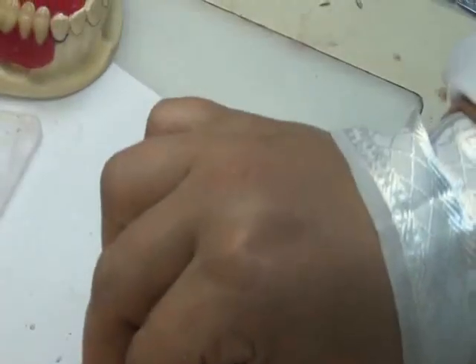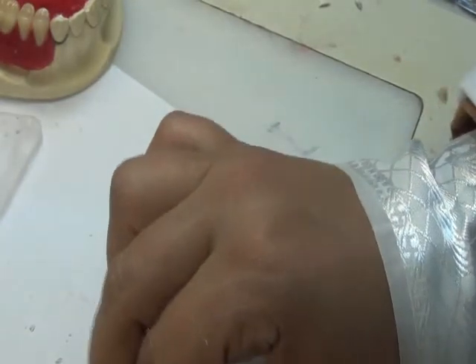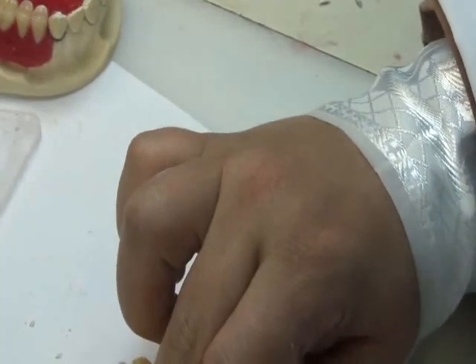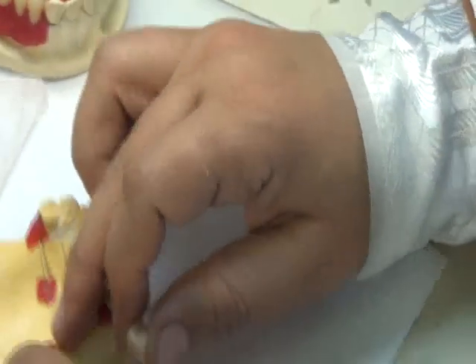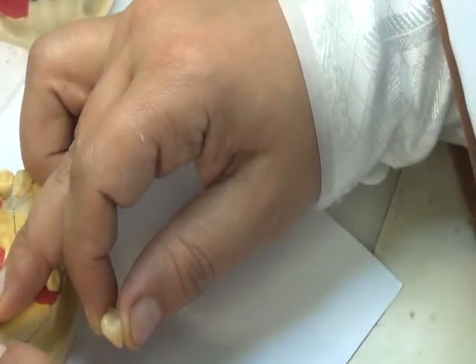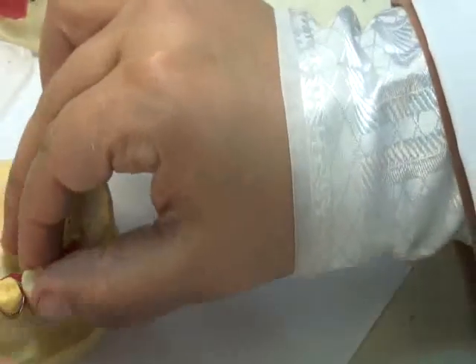Now I begin adding in teeth. So remember, I'm going to set the teeth using acrylic teeth. You will take them from inside, and I need to set the artificial tooth in contact with the natural tooth. Okay, so this is the artificial tooth.